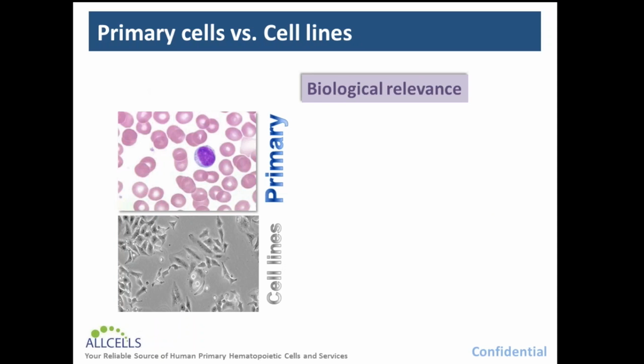When establishing a model to test a drug or a biological hypothesis, a logical consideration is its biological relevance to the in vivo system you are modeling.